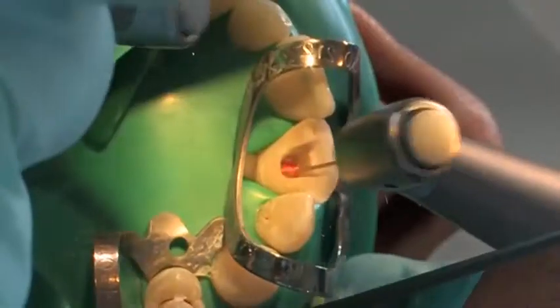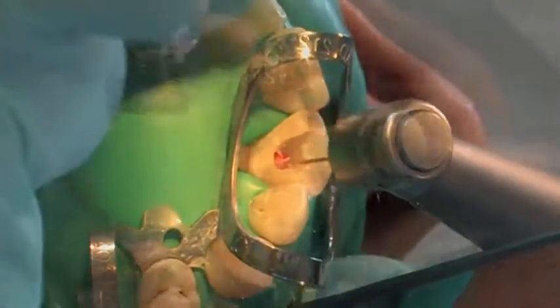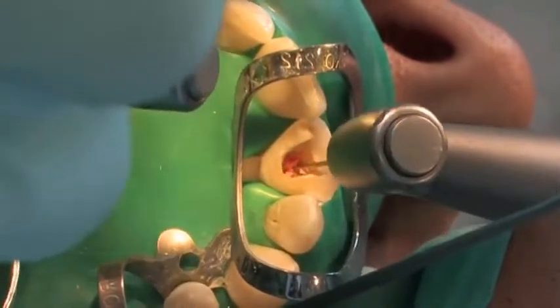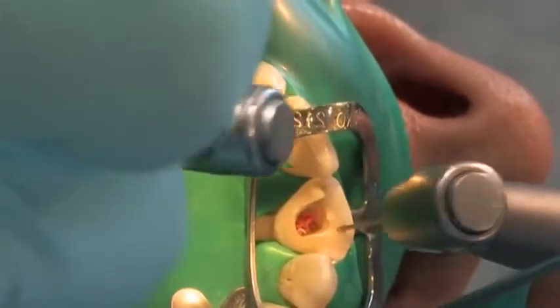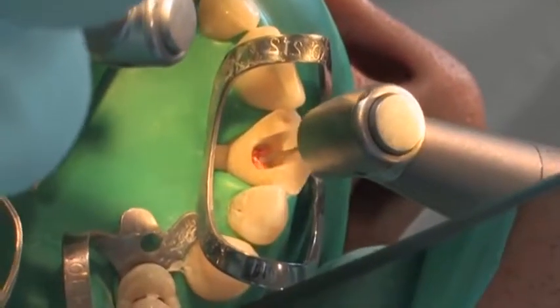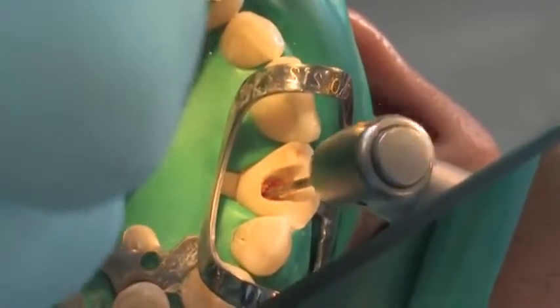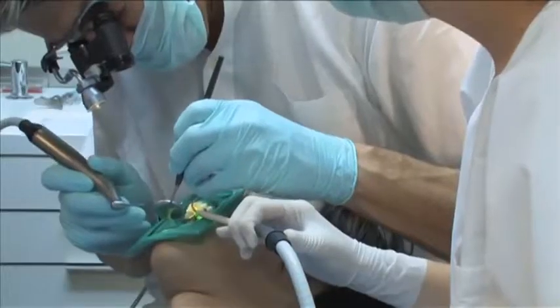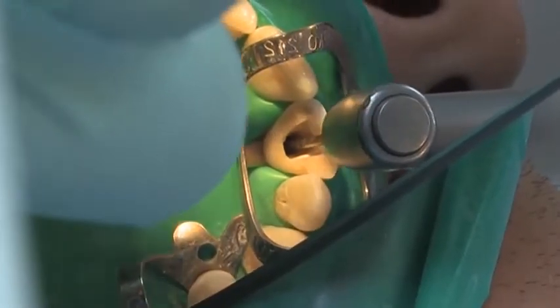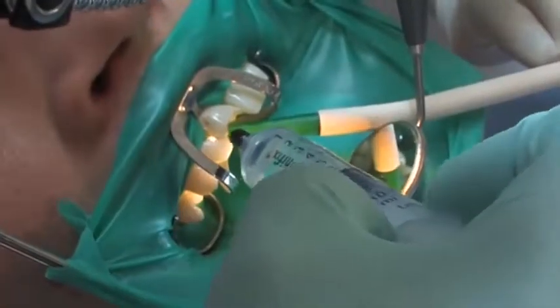The root canal filling material is removed to the predetermined depth using suitable root canal instrumentation. At least 4 to 5 mm of root canal filling should remain intact for an apical seal. The post space is then prepared using the color-coded ParaPost drills in sequentially larger sizes until the predetermined post diameter and depth is achieved. The root canal is rinsed using sodium hypochlorite.